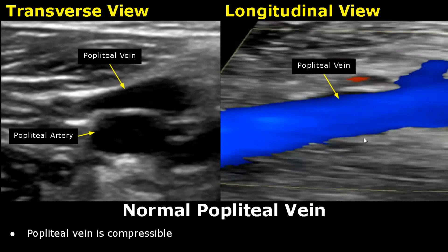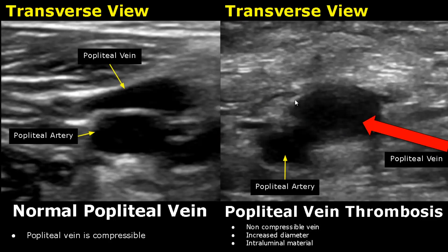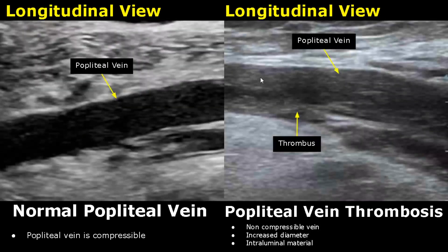Here is an image of the popliteal vein with color Doppler. This is a case of popliteal vein thrombosis. There is a blood clot present in the lumen of the vein. We will be unable to compress the vein with the probe — it is more rounded and has increased diameter. Here is another image of popliteal vein thrombosis in a longitudinal view. The vein will be non-compressible and intraluminal material is present.